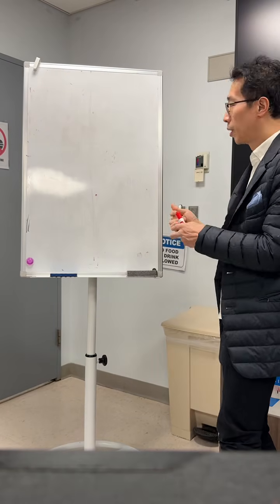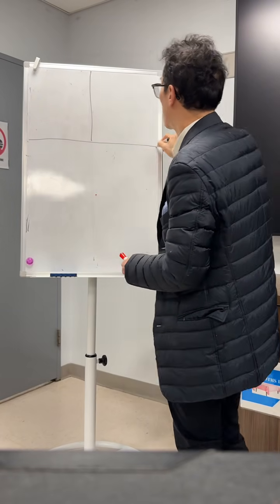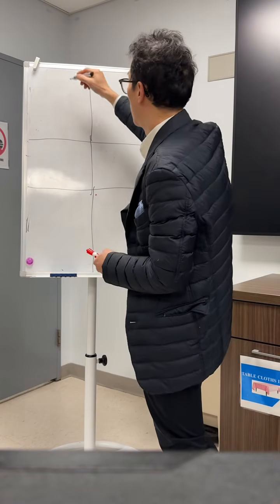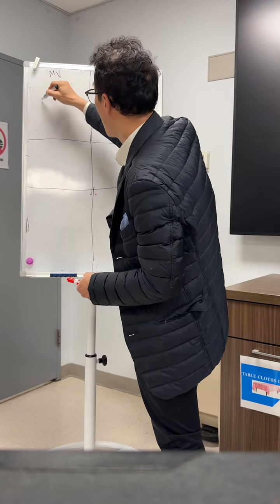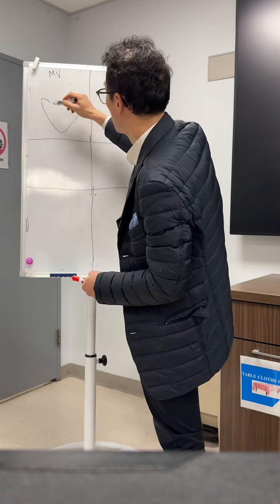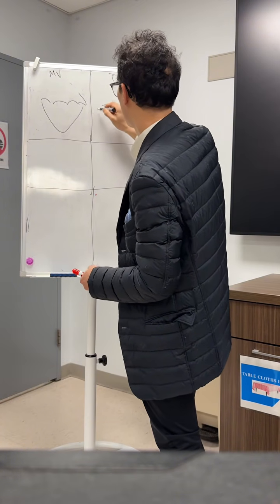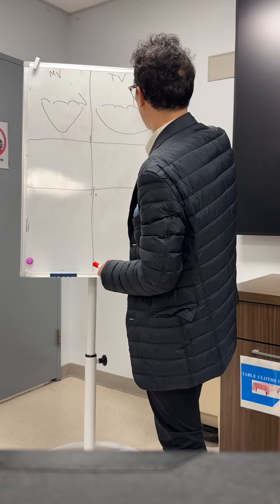Okay, so going back again with the mitral side and the tricuspid equivalent. And then we'll do the fluoroscopic equivalent. So going back again with the intercommissural view, and then here we have the RV inflow view and RVOT, aortic valve.